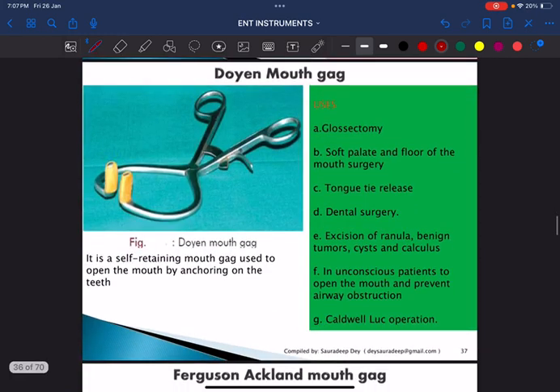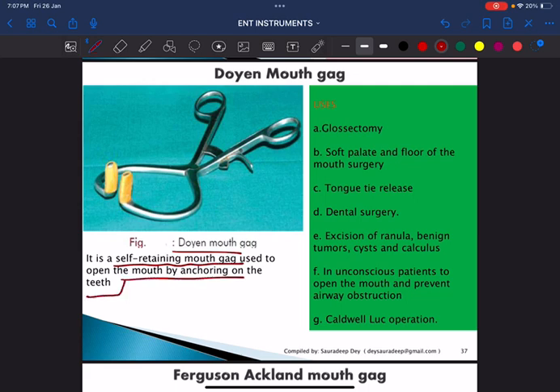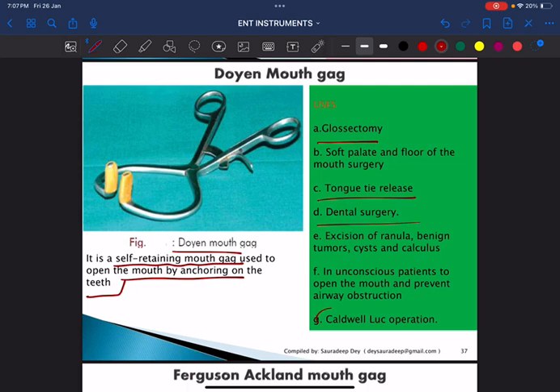This is Doyen's mouth gag, a self-retaining mouth gag used to open the mouth by anchoring on the teeth. It is used for glossectomy, tongue-tie release, dental surgery, Caldwell-Luc operation, and excision of a ranula or benign tumors.